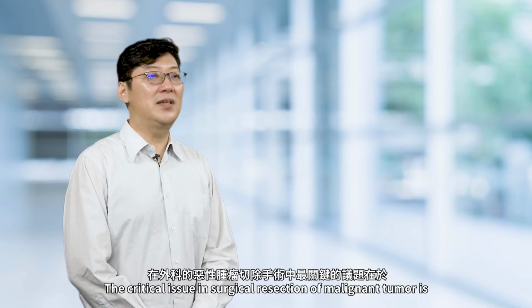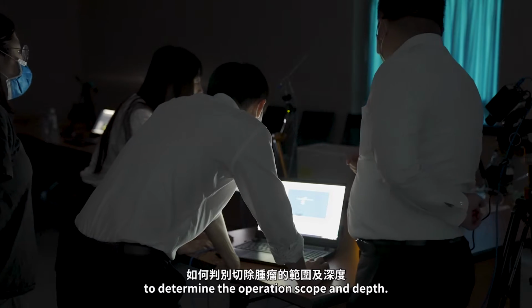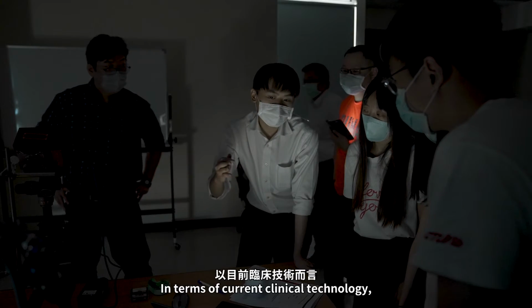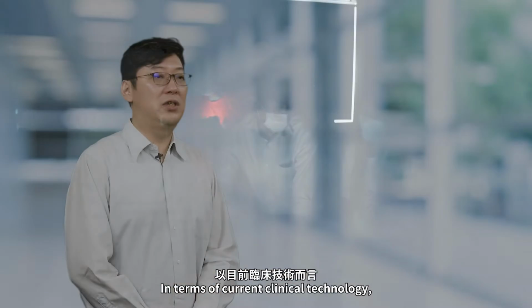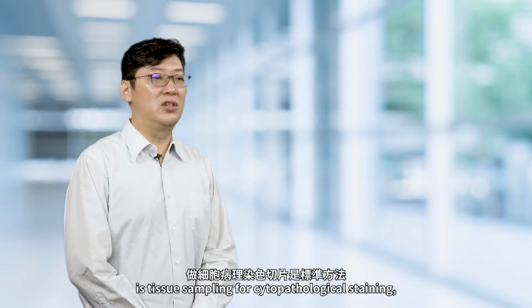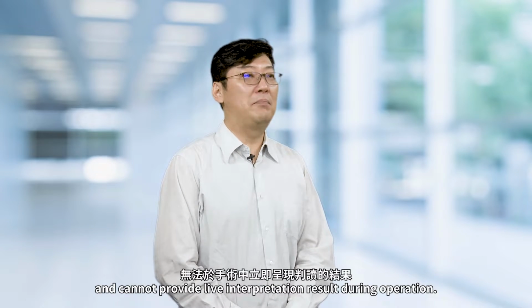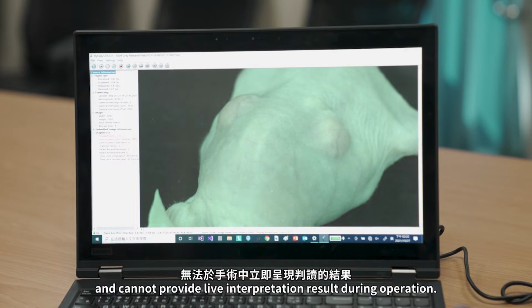The critical issue in surgical resection of malignant tumor is to determine the operation scope and depth. In terms of current clinical technology, the standard operation process is tissue sampling for cytopathological staining. However, it lacks immediacy and cannot provide live interpretation results during operation.